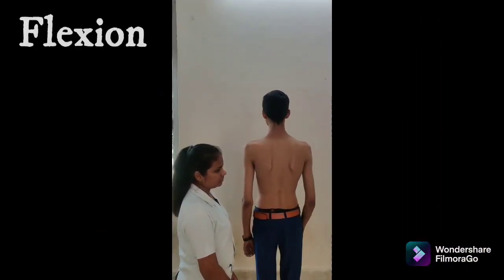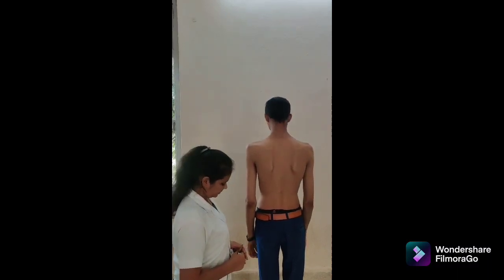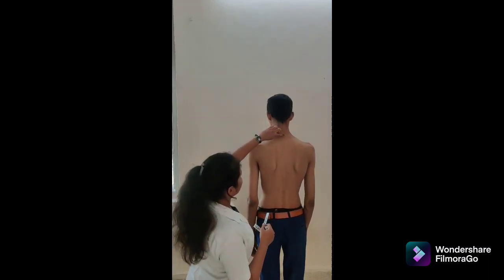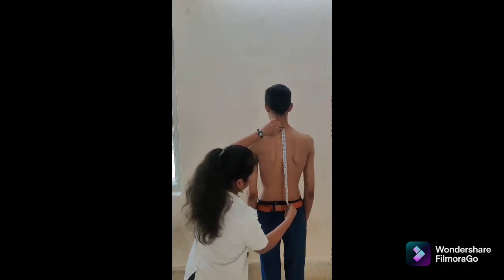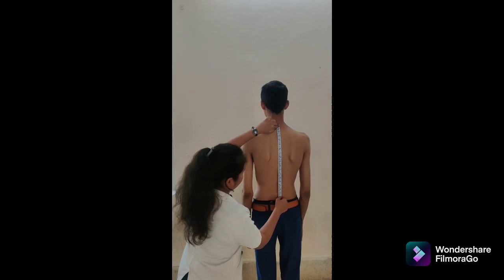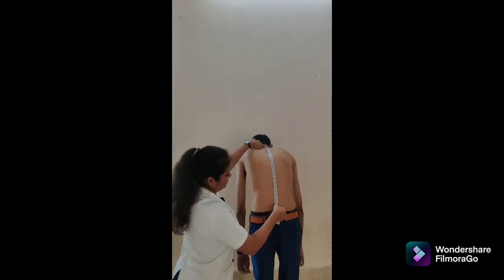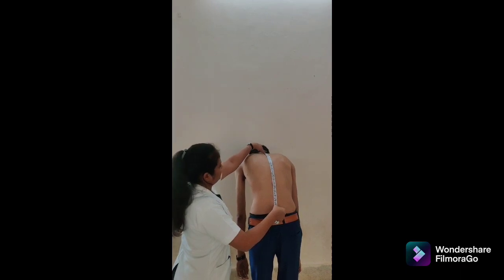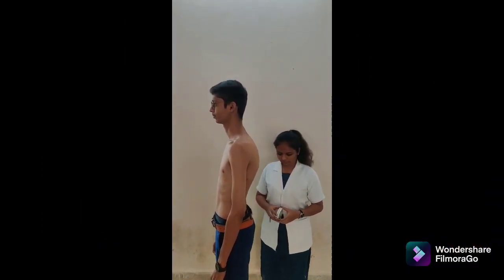There are three methods to measure thoracic lumbar flexion. First is tape measurement. Patient position: standing with feet together. Tape alignment: place one mark over the spinous process of T1 and the second on S2 vertebrae. Align the tape between two spinous processes and record the distance at the start of range of motion. Instruction: bend forward while keeping the arms relaxed and knees straight. Hold the tape in place. Record the distance at the end of range of motion. Normal range: 4 inches or 10 cm.